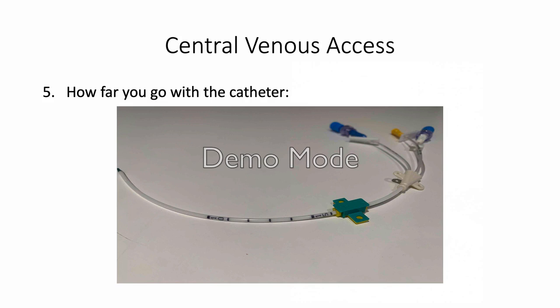One more thing, the ultrasound is very helpful to make sure that your guide wire is inside the vein.